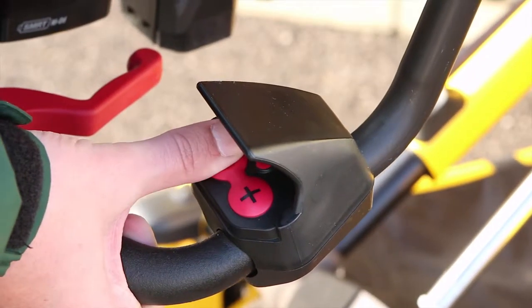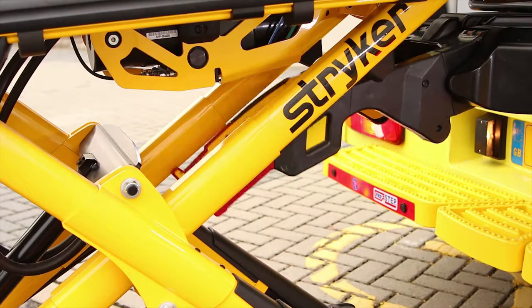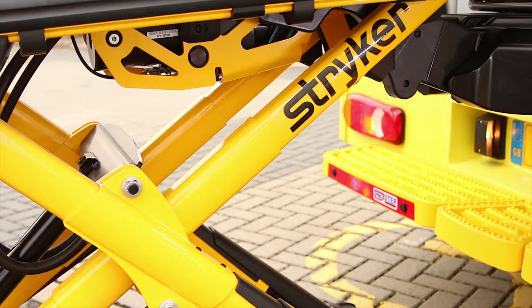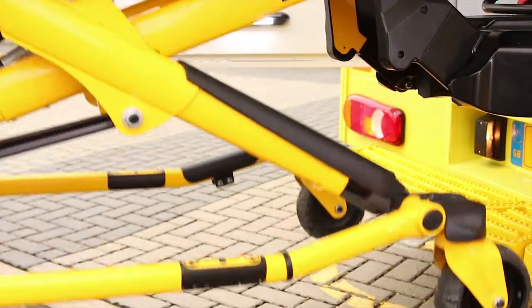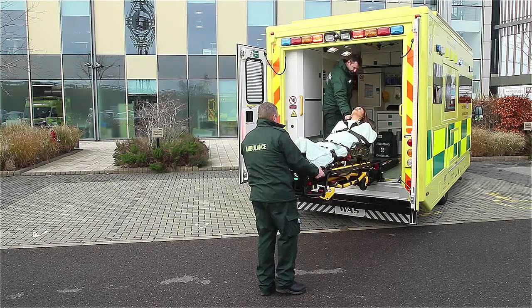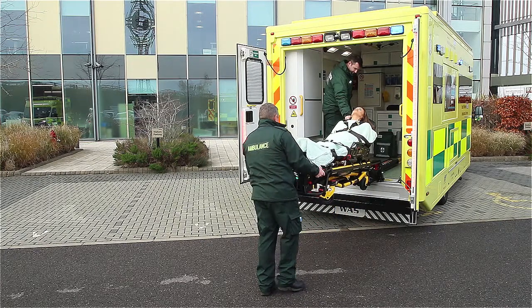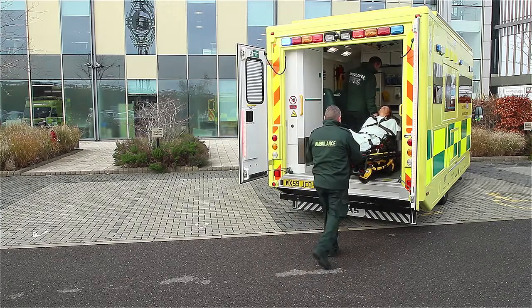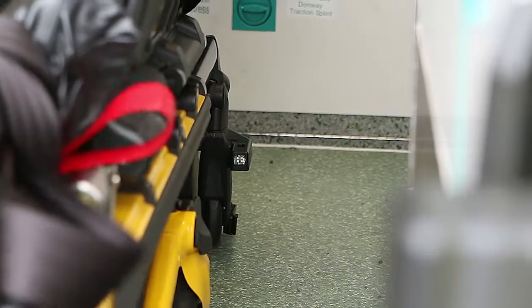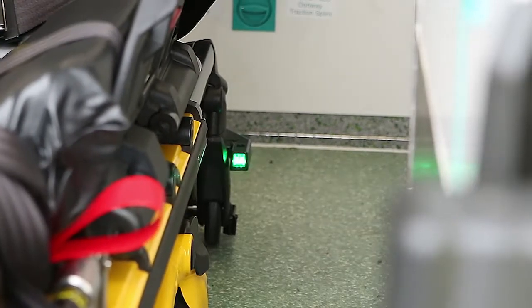Press and hold the minus button on the stretcher. The first sound you hear is the arms of the PowerLoad raising and taking the weight of the stretcher; the second sound is the stretcher legs retracting. Continue raising the stretcher until it stops at the loading position. Guide the stretcher into the vehicle until it comes to a complete stop, and the PowerLoad will lower into the locking position automatically.